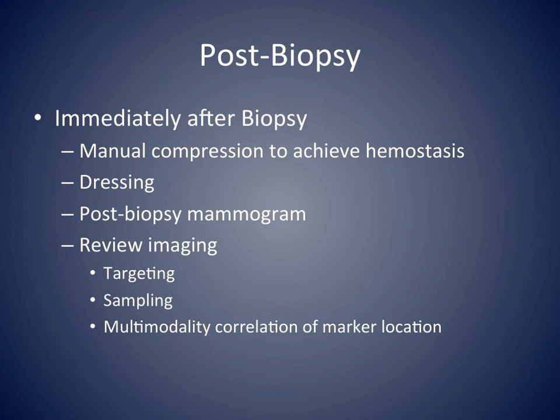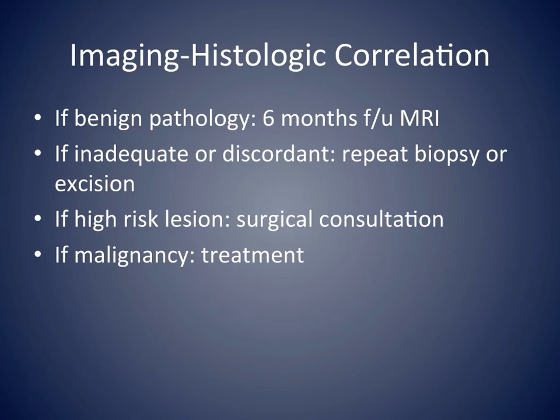After the procedure, it is important for the radiologist to review all the MRI biopsy sequences and the post-biopsy mammogram to verify whether the lesion was sampled adequately and the clip was placed correctly. Proper documentation should be stated in the report. As for any breast biopsy, the radiologist needs to correlate the imaging and pathology findings to assess for concordance.